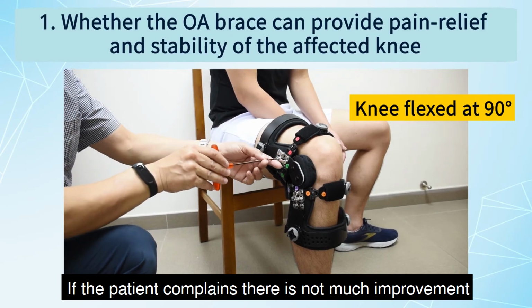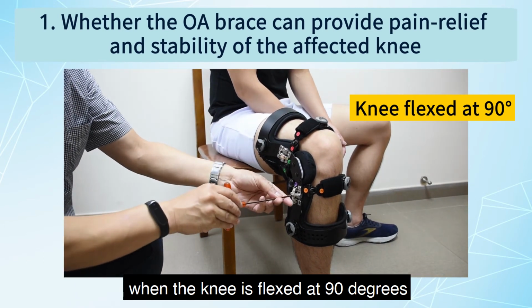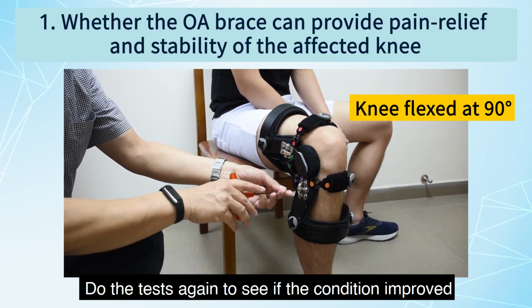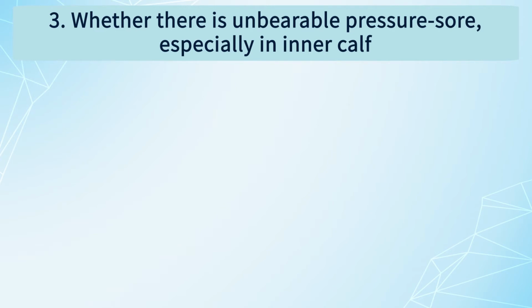If the patient complains there is not much improvement, the therapist can increase the valgus force slightly when the knee is flexed at 90 degrees. Do the test again to see if the condition improved. Note that the OA knee pain cannot completely disappear for first-time use. It will gradually improve after some time. Increase valgus force when the patient gets used to wearing the brace, so the OA knee pain will be further relieved. 3. Whether there is unbearable pressure sore, especially in inner calf.